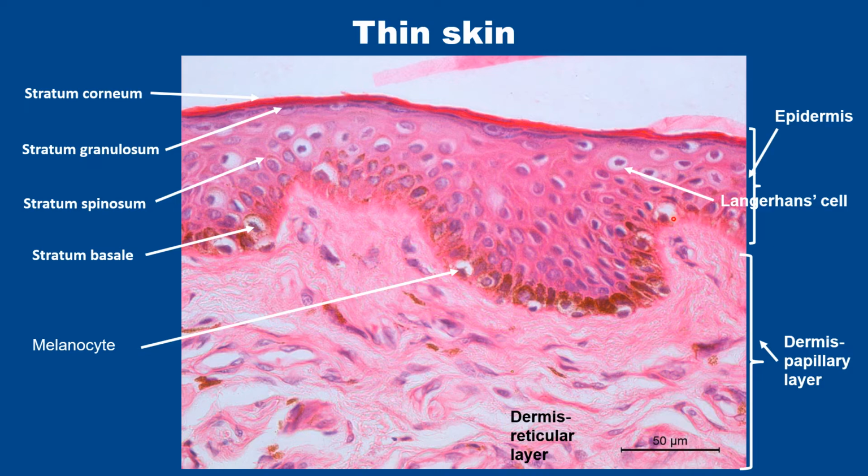The melanocytes, see the position of the melanocyte. The melanocytes are at the stratum basal, and the Langerhans cells are in the stratum spinosum. Both the cells have space around them, and there is no junctional complex or spines, but the Langerhans cells are present in the stratum spinosum. Melanocytes are never seen in the stratum spinosum.